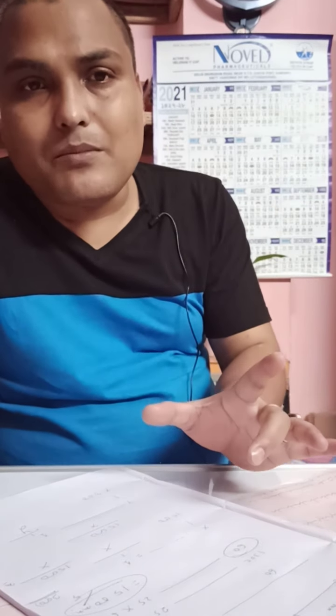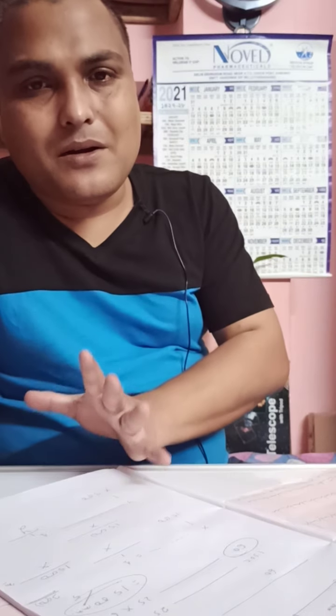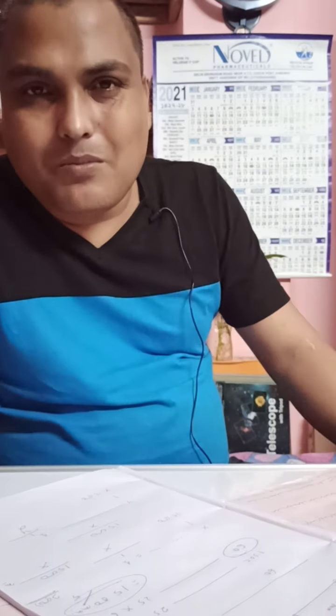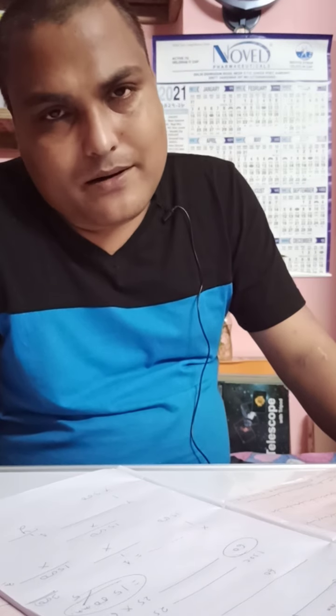There are different types of block, type 1 and type 2 block, and different types of AV block, or there may be a junctional rhythm, where the AV node is taking the upper hand.